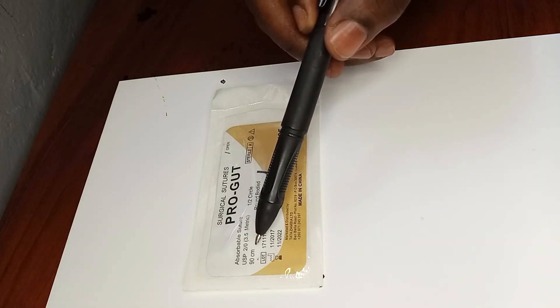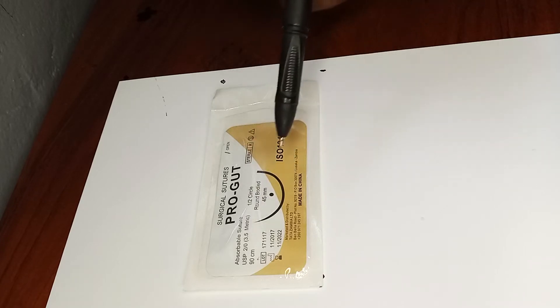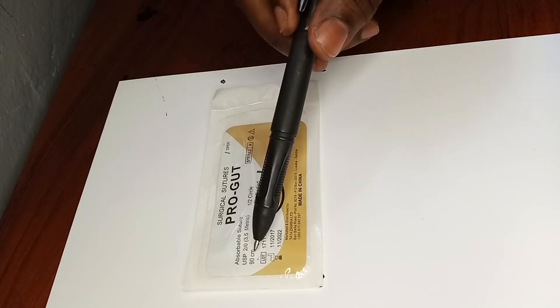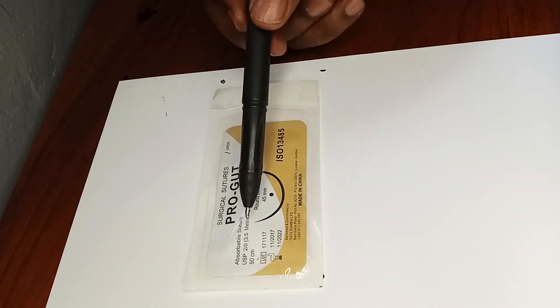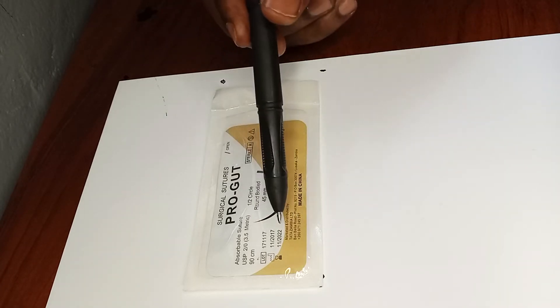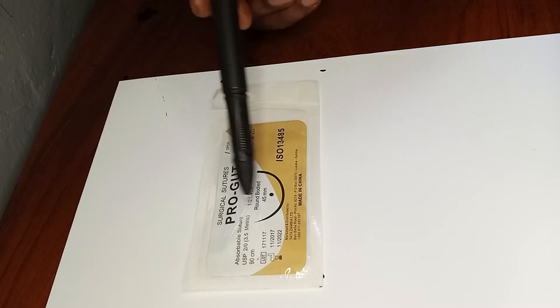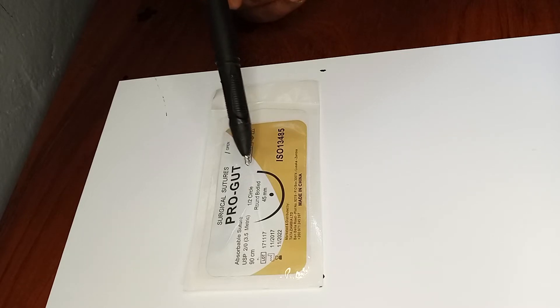We have the number 90 centimeters — that is the length of the thread. The whole thread inside this pack will be about 90 centimeters, which is almost close to one meter. Then of course there's the manufacturing date and an expiry date, which is important because it may speak to the strength of the suture.